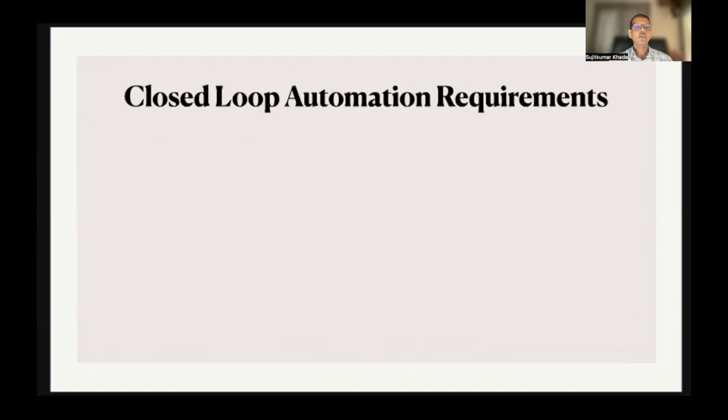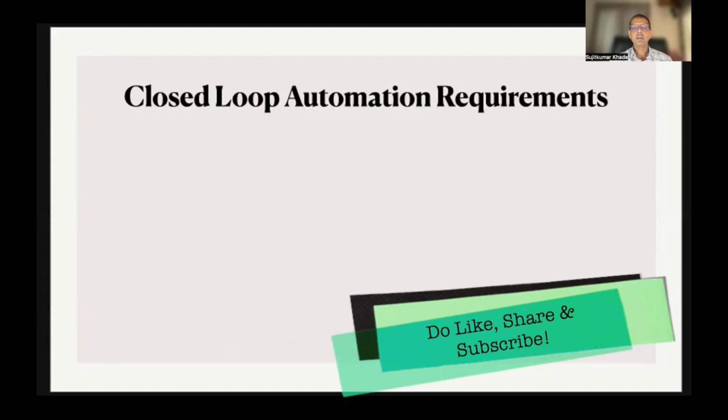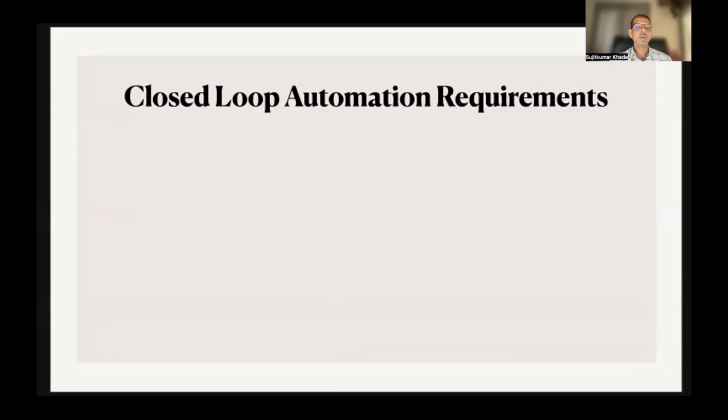The closed loop automation requires a reliable source of data upon which to make decisions. For example, programming a hypothetical capnography linked ventilator as noted in the above example is a straightforward task governed by well-characterized physiological principles of carbon dioxide production and minute ventilation. These relationships degrade significantly in the presence of data artifact. Therefore, we need to have data which is reliable, real-time, and reproducible.